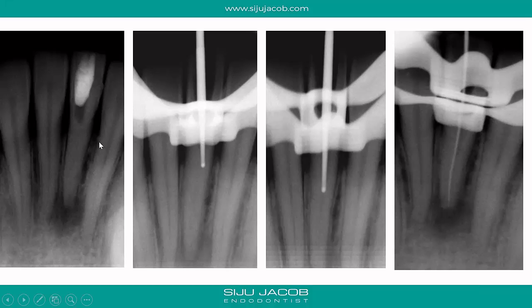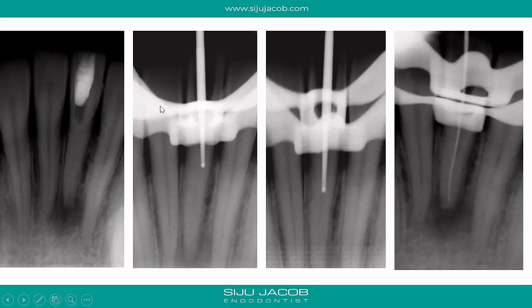Calcifications almost always occur from a coronal to apical direction. The calcified part of the canal will be coronal and the patent part of the canal will be apical. So the trick is to stay centered until we can find the patent part of the canal. In single-rooted teeth, we apply the law of centricity, and we know that the single canal present is usually in the center of the tooth.